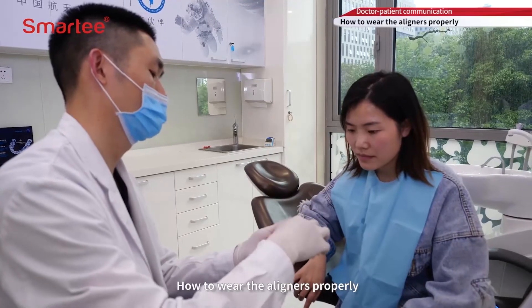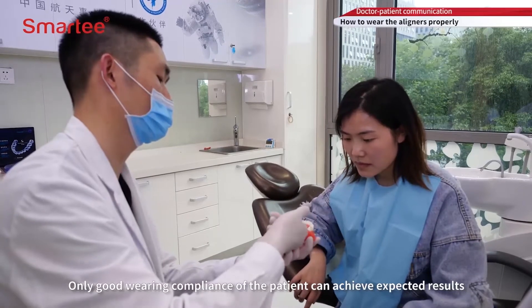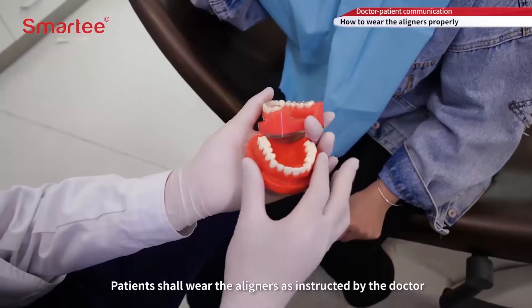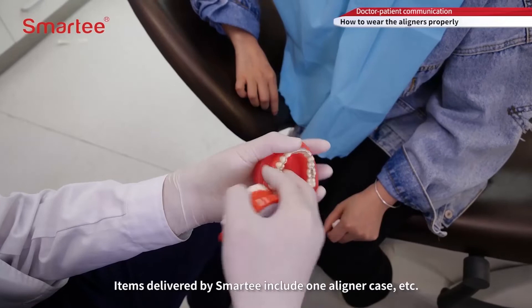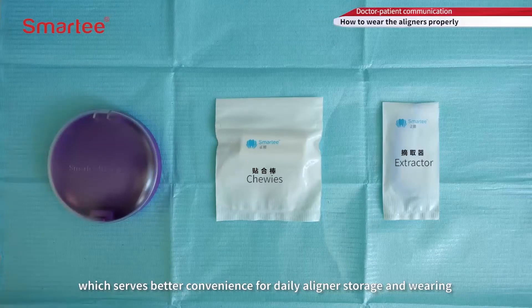Only good wearing compliance of the patient can achieve expected results. Patients shall wear the aligners as instructed by the doctor. Items delivered by Smartee include one aligner case, which serves better convenience for daily aligner storage and wearing.